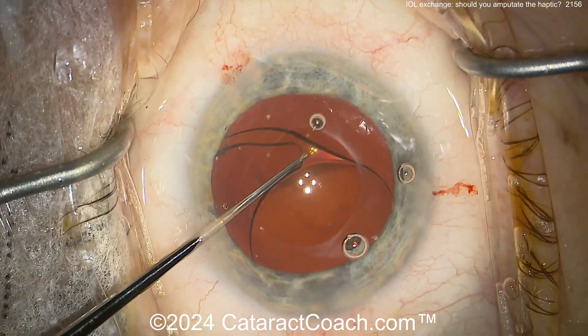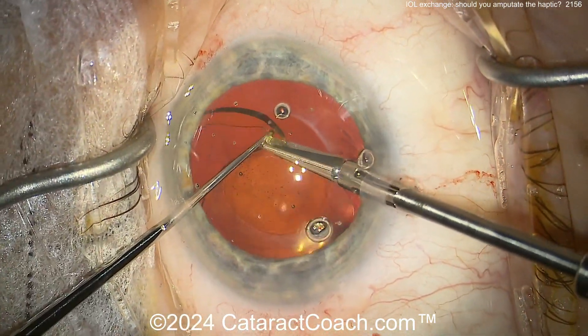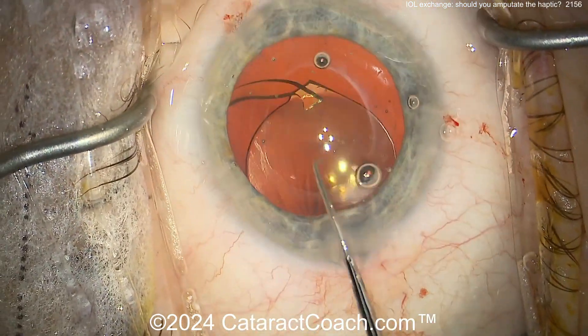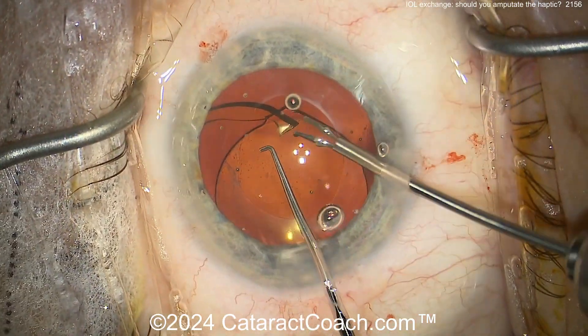Let's see — or maybe an amputation. Micro scissors again, and amputate. Maybe it'll be easy once you get the optic out of the eye — you can have a little more space to use a two-handed approach to try to get that last remaining haptic out.